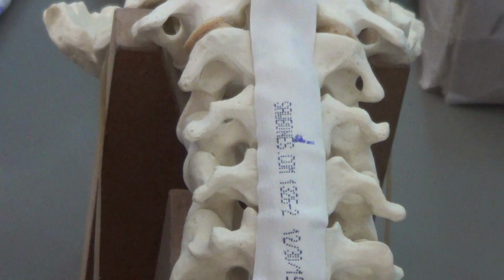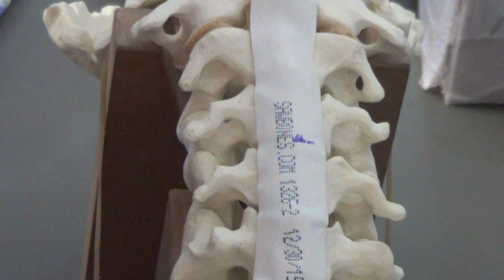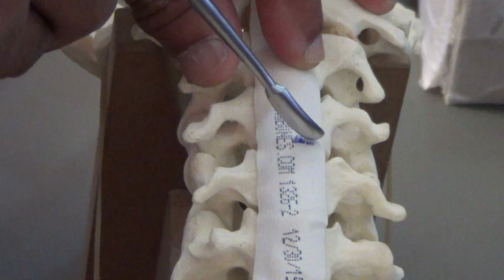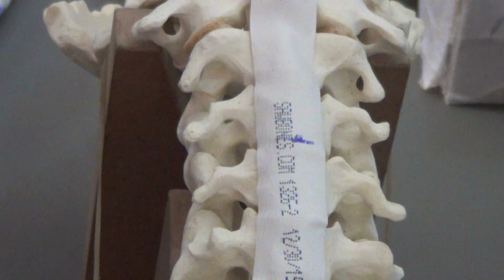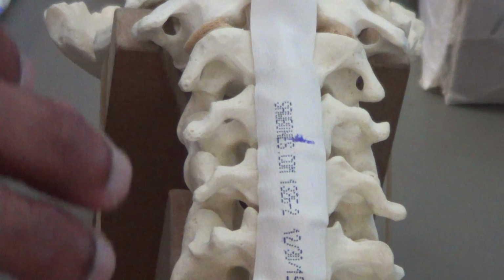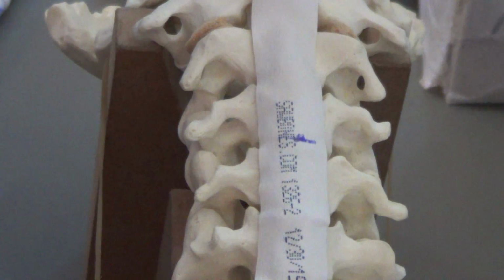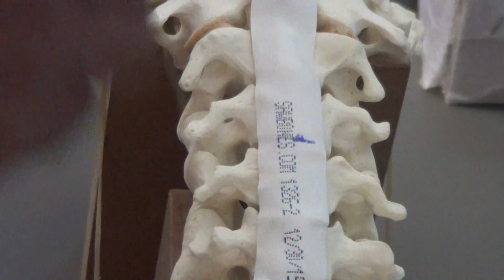Then what you do, you have a knife. You use a knife and cut the anterior longitudinal ligament. But before that, what you do is usually you put a distractor. A distractor is something, you see, you put a distractor here. We don't have it here, but you put a distractor in the disc below and the disc above. You put a pin first, and then these pins come on either side of the disc. Then you put the distractor.